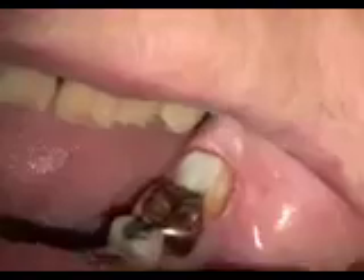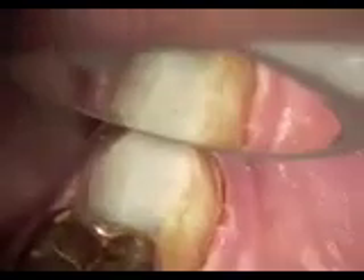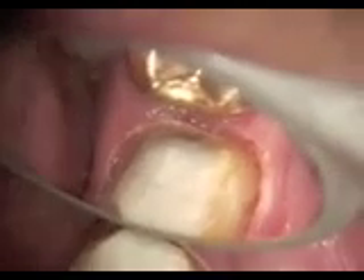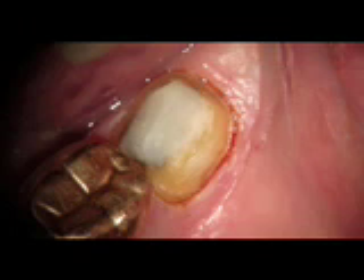You can see here the blue handpiece and the laser. We're almost complete here — with the actual view you can see afterwards. We've completed the troughing, using the mirror to show a little bit of the view here. Now we're ready for the impression. This is the tooth before troughing, or after troughing, and ready for impressions.